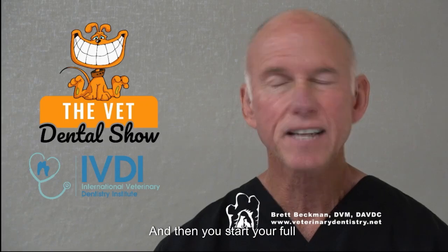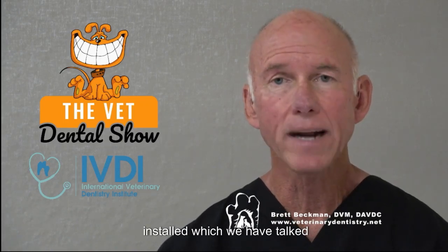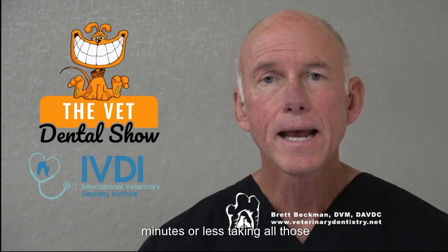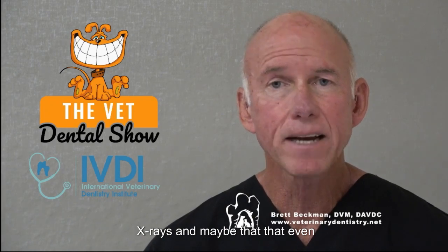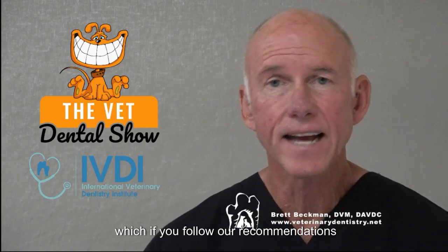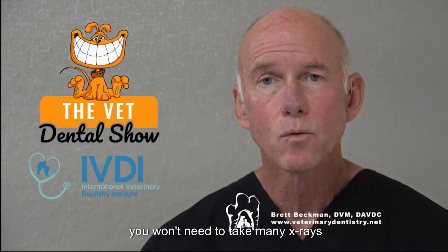And then you start your full mouth radiograph series with your templates installed, which we have talked about, or will talk about in one of the efficiency episodes. That way you can go around that whole patient within 8 minutes or less, taking all those x-rays. And maybe that even gives you time to take an extra x-ray or two, which, if you follow our recommendations in the template efficiency podcast, you won't need to take many x-rays.